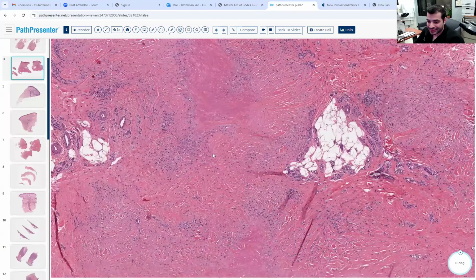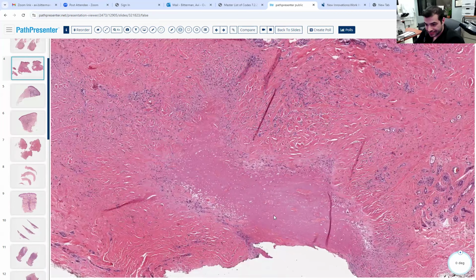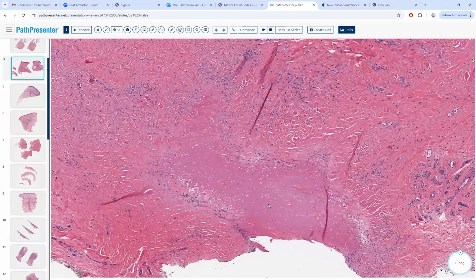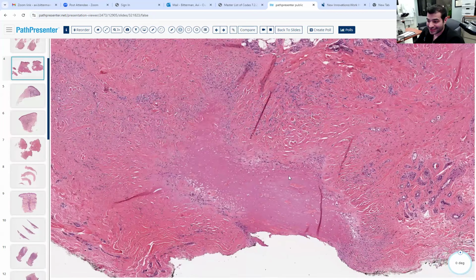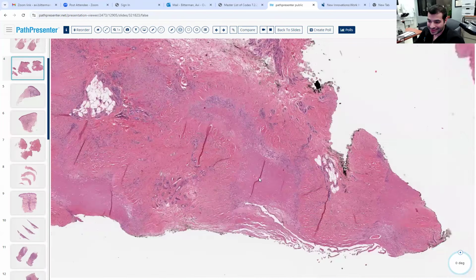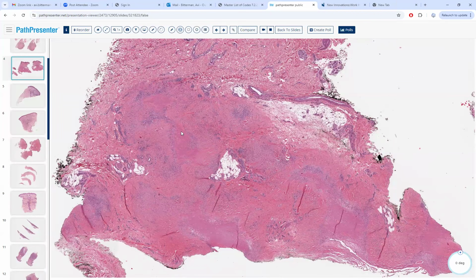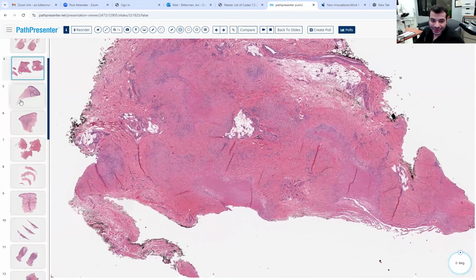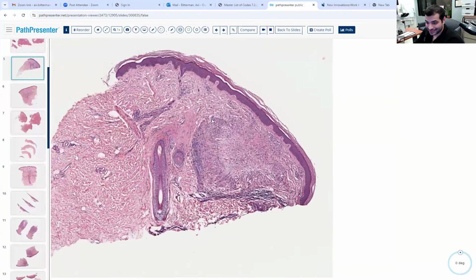So we have to make a decision. Do we think this is fibrin or mucin? It looks more fibrinoid. So it looks more like fibrin. Rheumatoid nodule. This was a rheumatoid nodule. Very good. If you wanted to confirm, what stain would you use? Colloidal iron. You put a colloidal iron on it, to see if there's mucin.